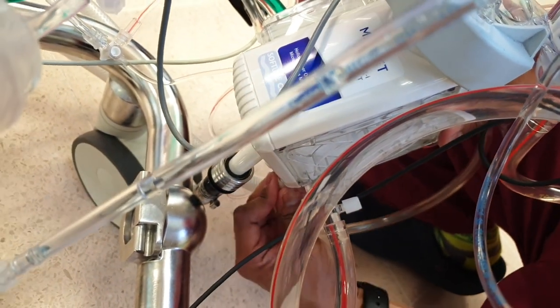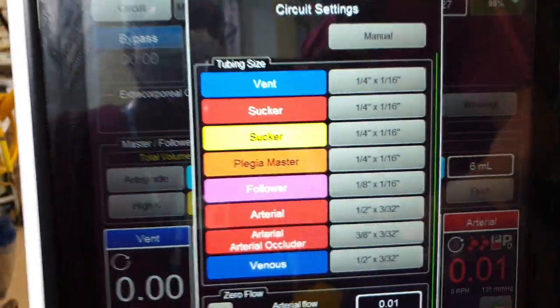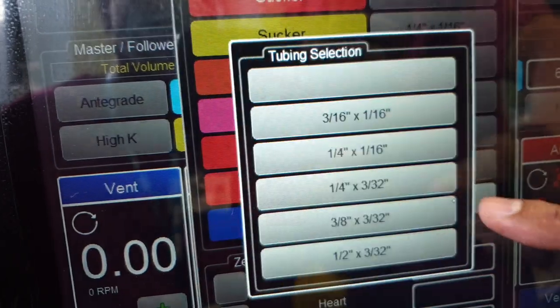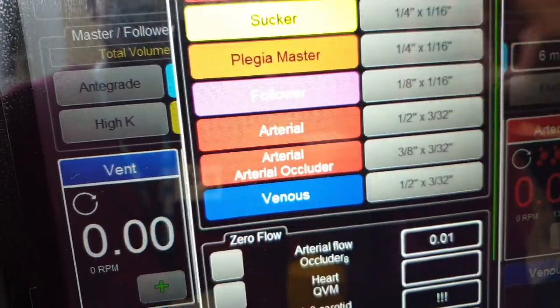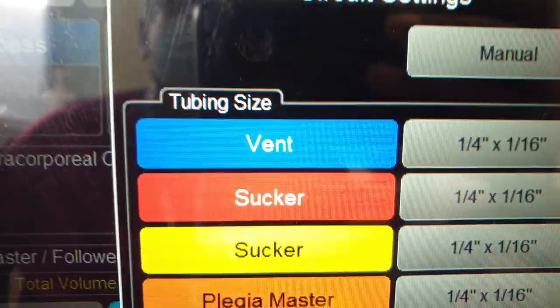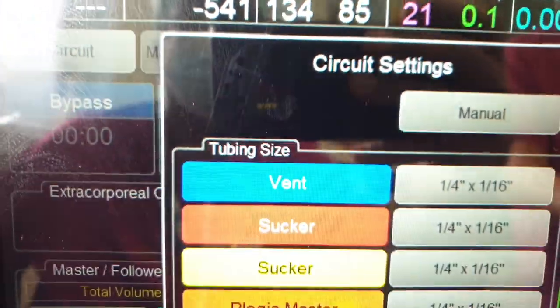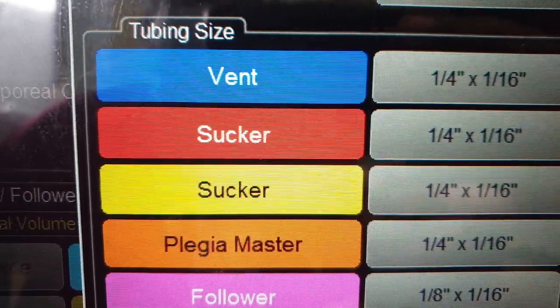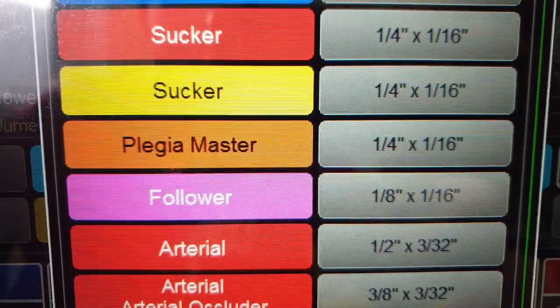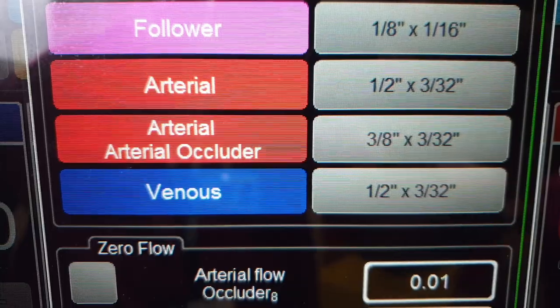This is included in our setup. This screen will appear. So that's your sizes. If you want to change, just hit it, then select whichever you want. You can save or not. This is all color coded.